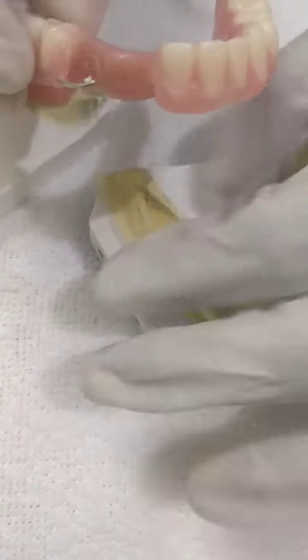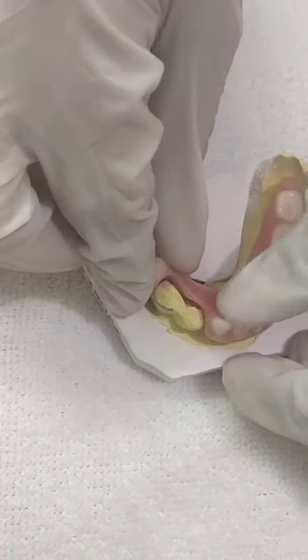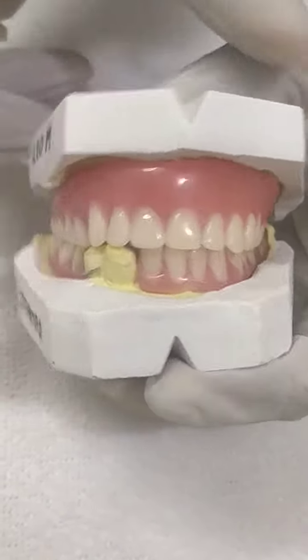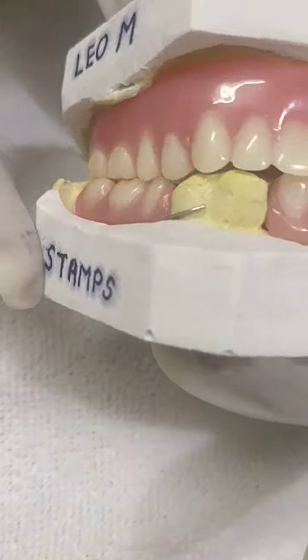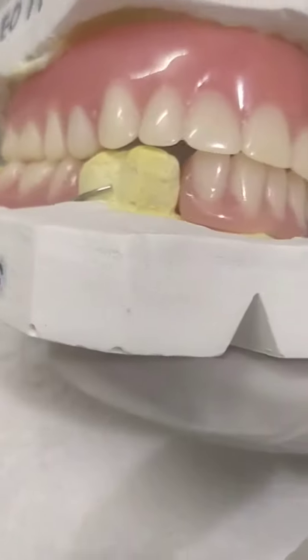It is having good retention — you can just press this clasp to engage the tooth. Now you can see a good seating and a good fitting. You can also check the occlusion — all the teeth are in good occlusion. Thank you, goodbye.